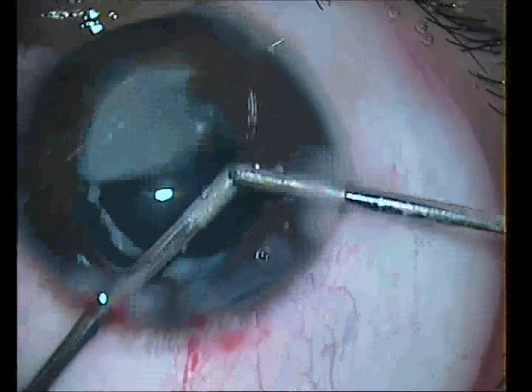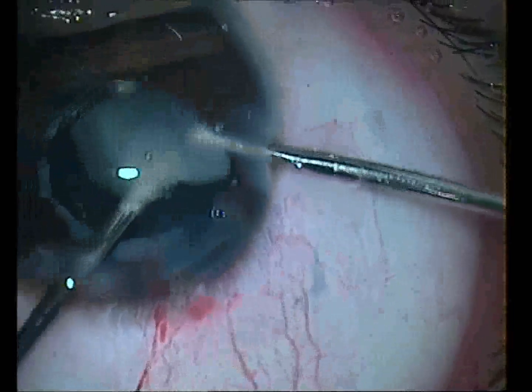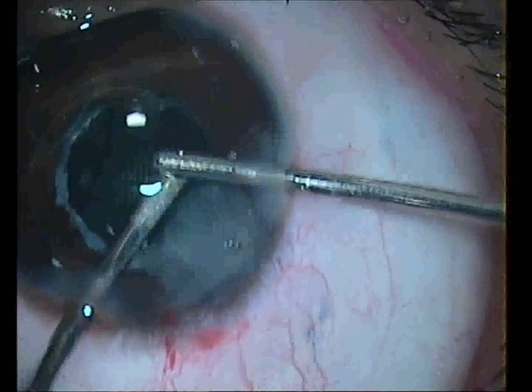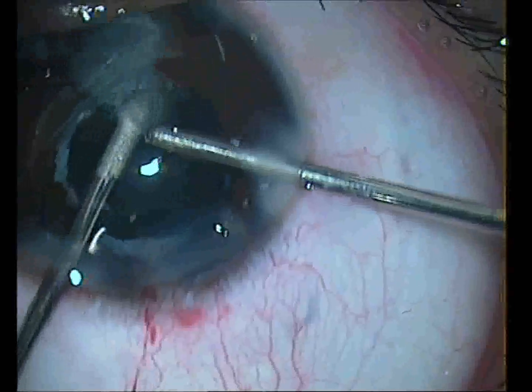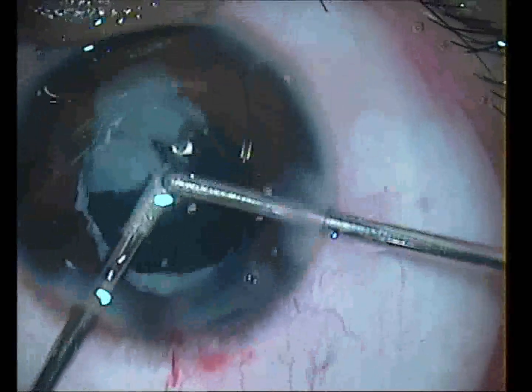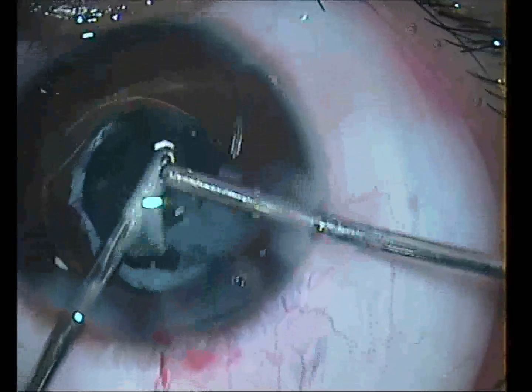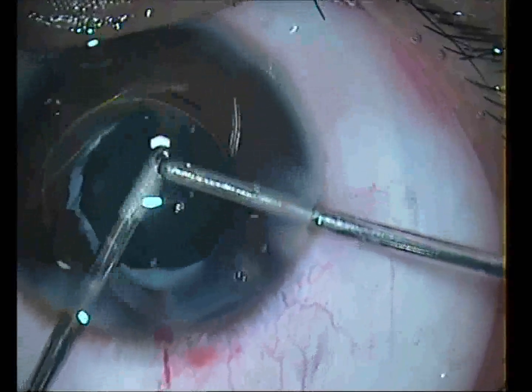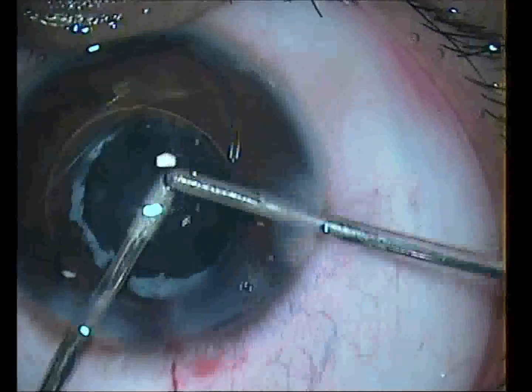Now you can see the whole of the soft nucleus has been aspirated out with the irrigation aspiration, keeping the vitreous back in the posterior segment and not allowing it to come into the anterior part.